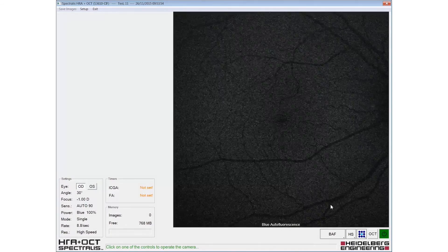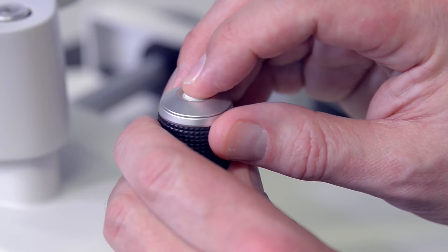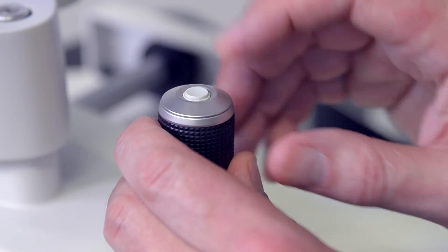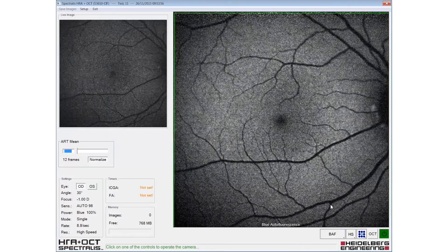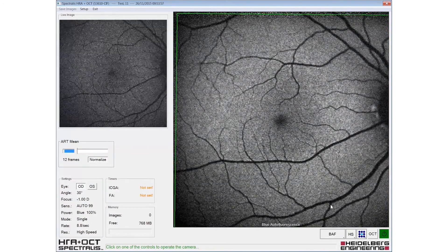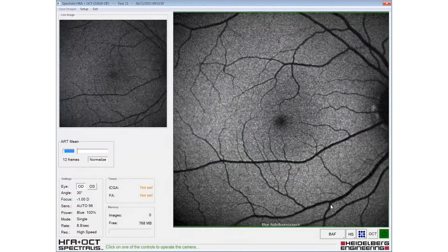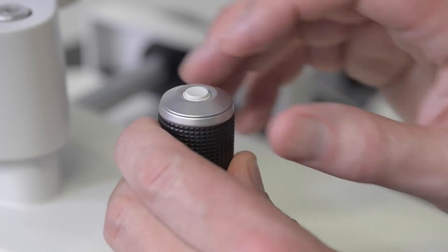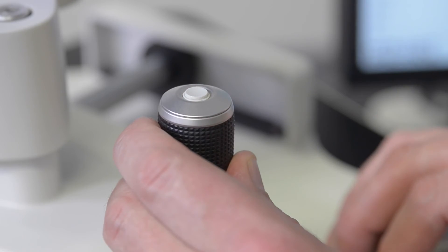The eye tracking and automatic real-time engage with the long press of the joystick button. Once the ART value reaches the desired number of frames, images can be acquired with a short press of the button.